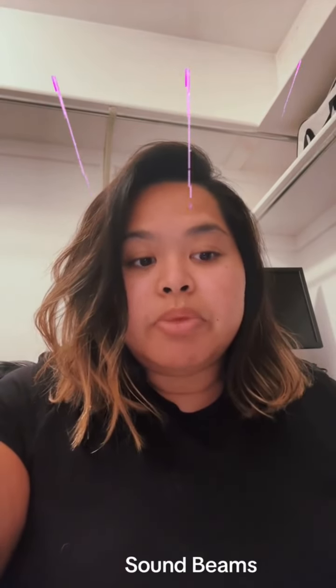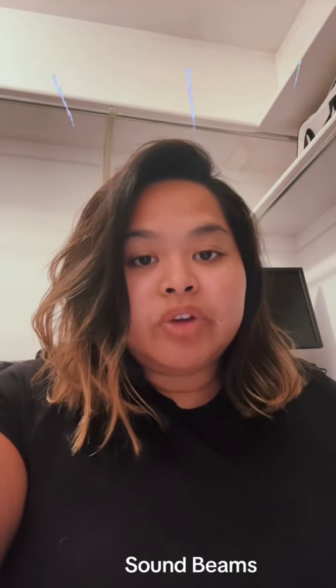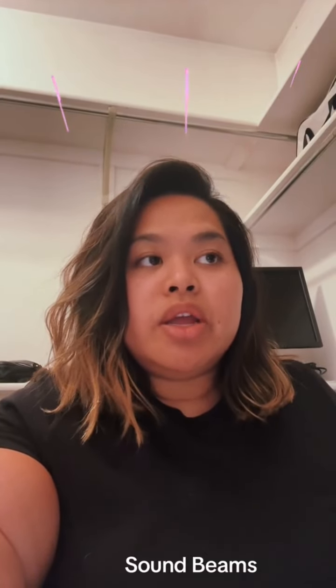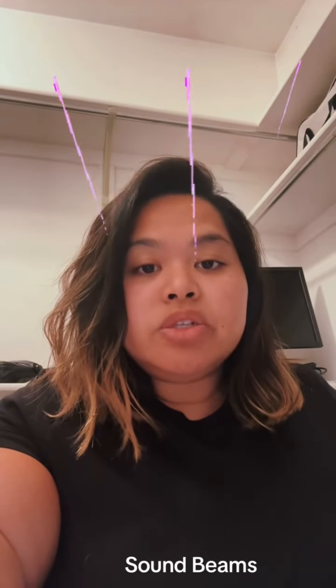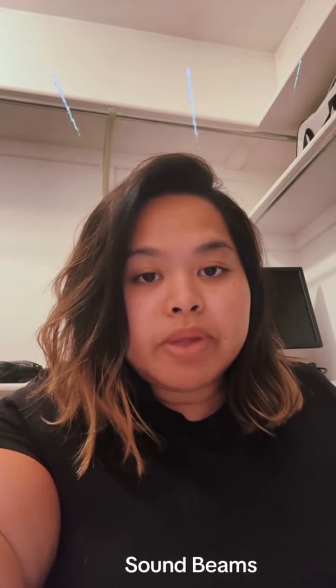This region is located from the focal point and beyond as it extends deeper. In this zone, the beam diverges or spreads out. When the beam is two near zone lengths from the transducer, the beam is the same size as the active element. If it passes two near zones, the beam is wider than the active element.